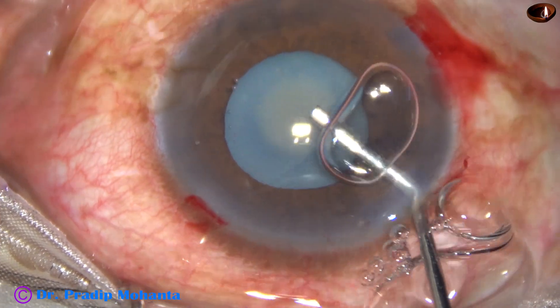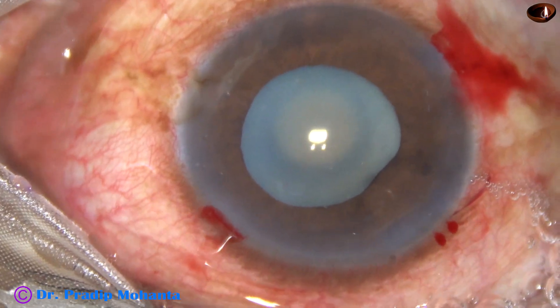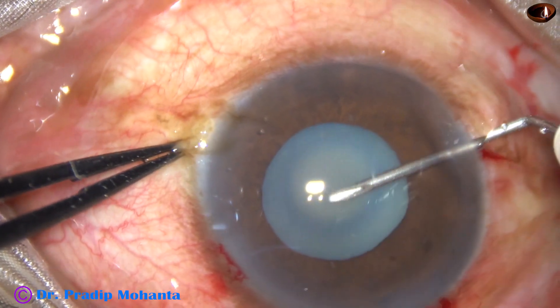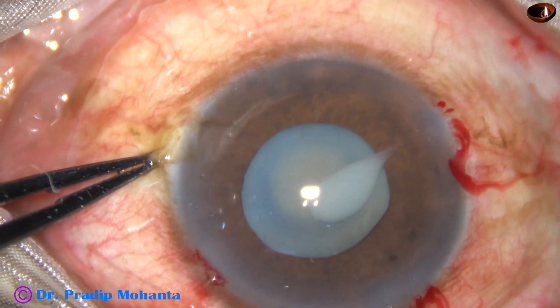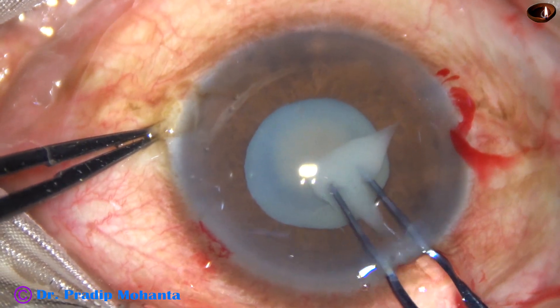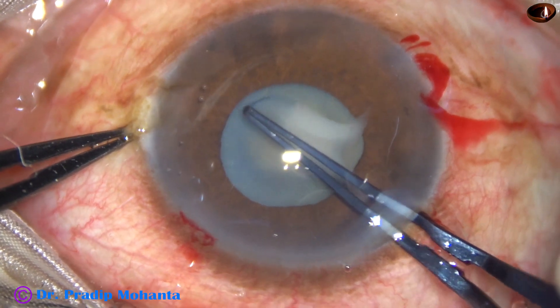Now the anterior chamber is filled up with 2% hydroxypropyl methylcellulose. Now, capsulorrhexis. As soon as the anterior capsule is incised, milky fluid comes out. This indicates it is a hypermature Morgagnian cataract. Rhexis is being attempted with a utrata forceps.